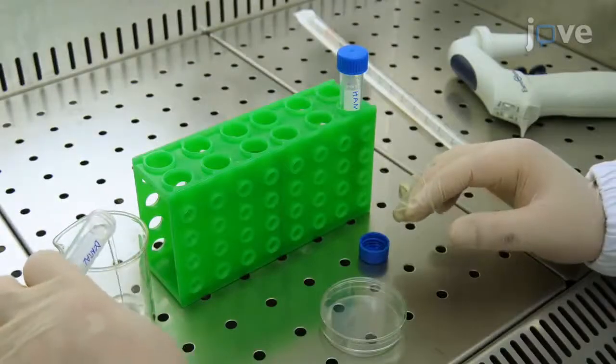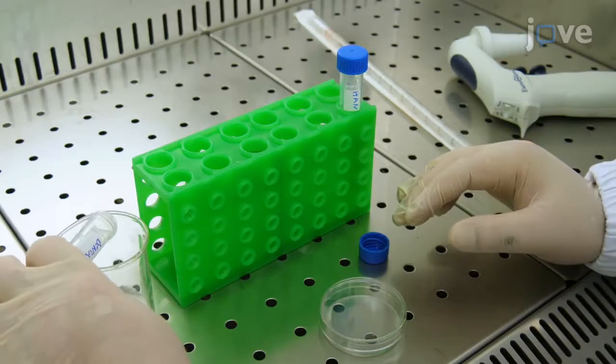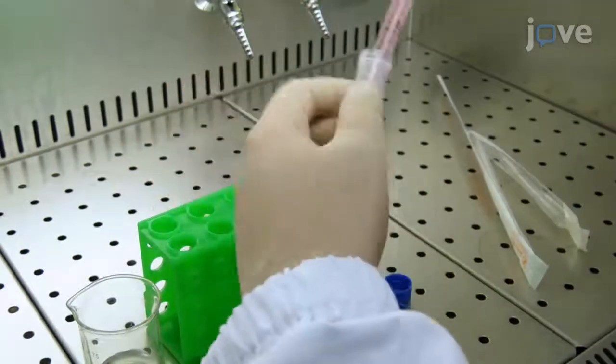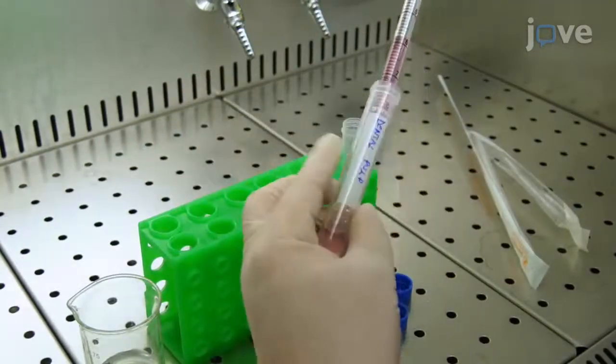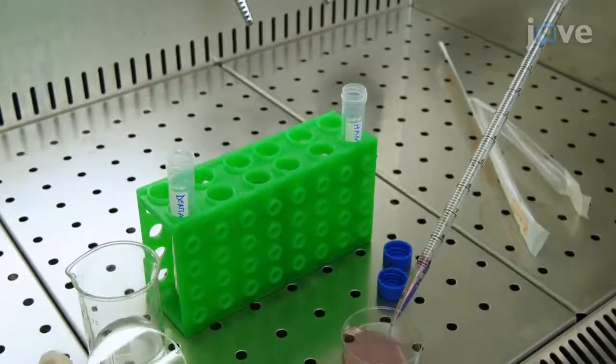After the centrifugation, remove the supernatant. Re-suspend the pellet in Hanks solution and transfer the sample to a petri dish.